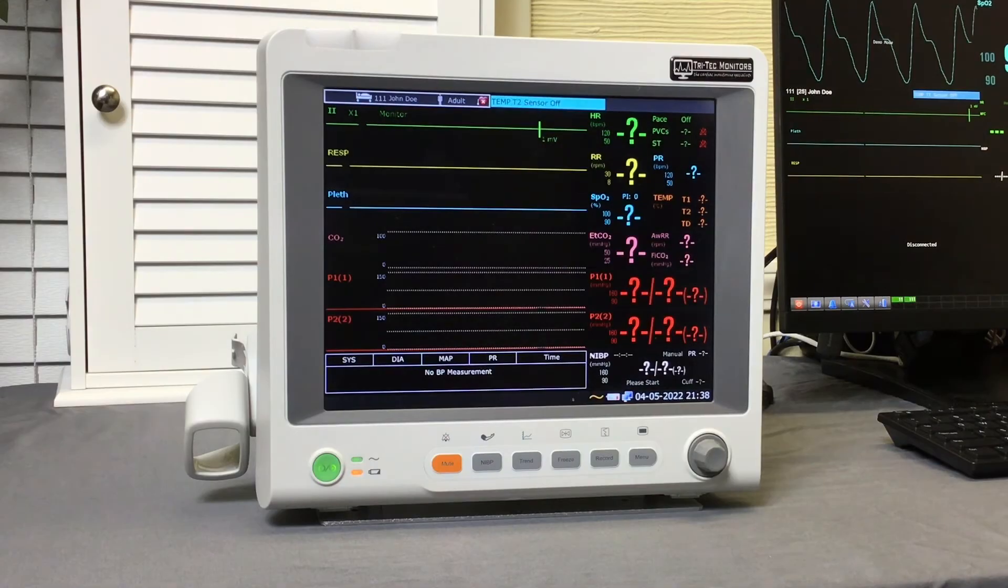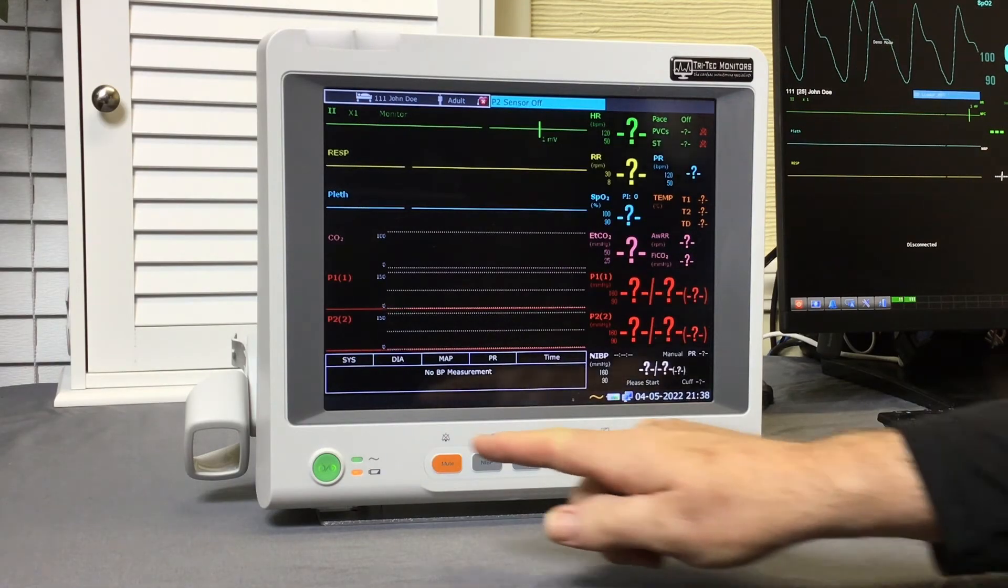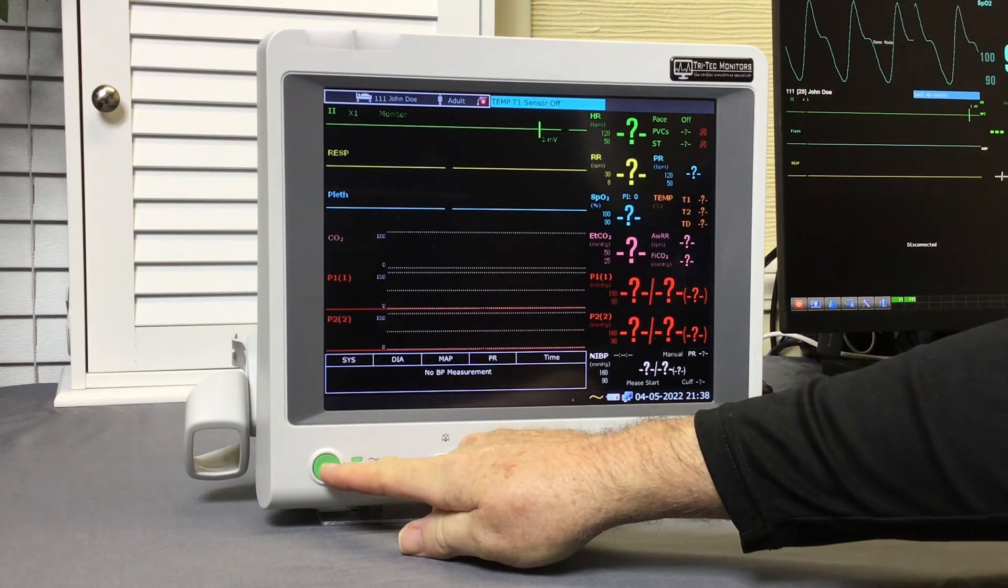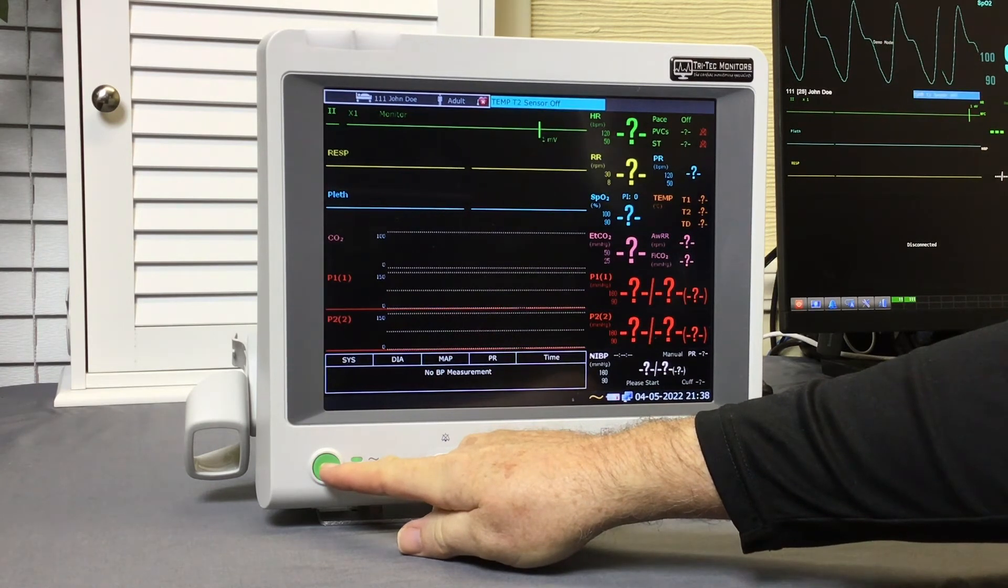Step 1. Make sure to cycle the power on the bedside monitor. That means turning the unit off and then back on again.